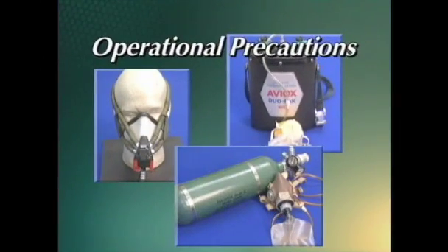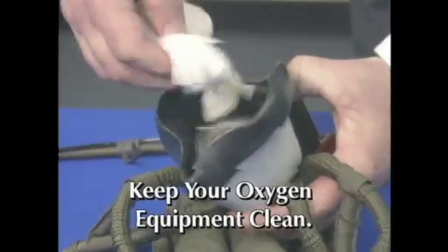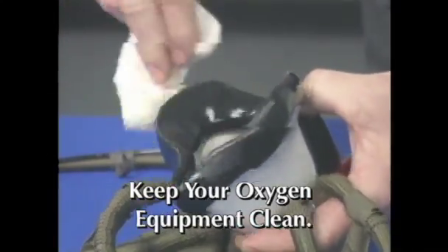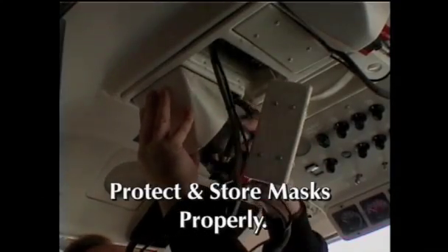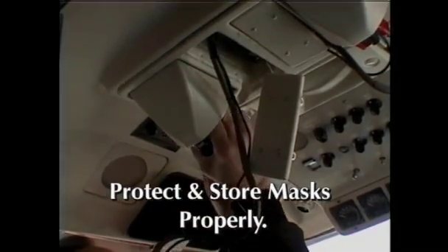Some operational precautions to use with all oxygen systems are: keep your oxygen equipment clean. For proper cleaning instructions, check with the manufacturer of the mask. The interaction of oil-based products with oxygen creates a fire hazard. Additionally, oil attracts dirt particles, which contaminate storage containers, regulators, masks, and valves. Protect your oxygen mask from direct sunlight and excess dust. Store masks properly.